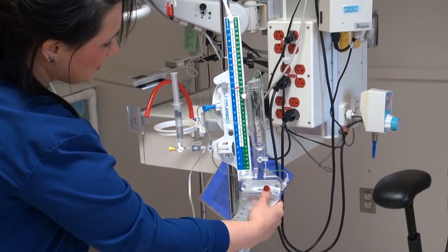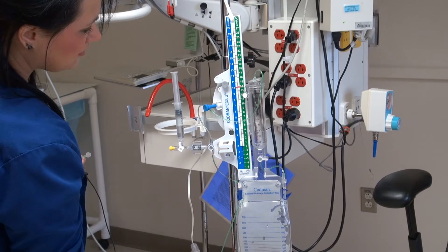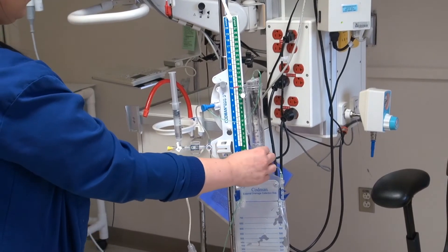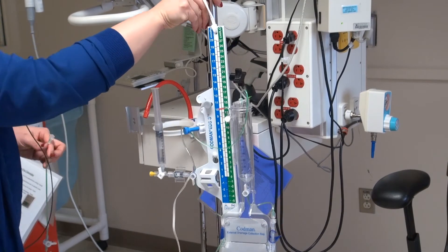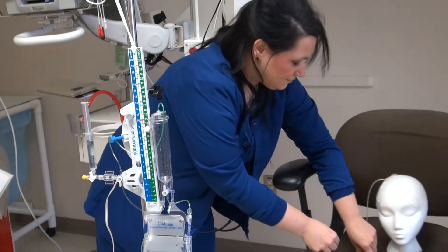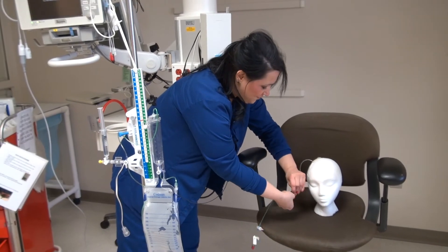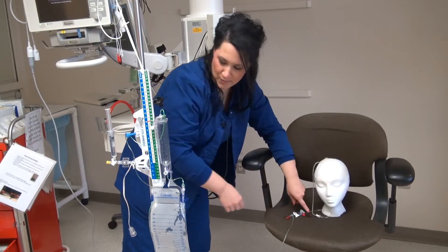Let's open this drain up, let this saline come down, shut it off, and then we will connect to our head once the surgeon is ready. We also want to make sure all our stopcocks are open as well.